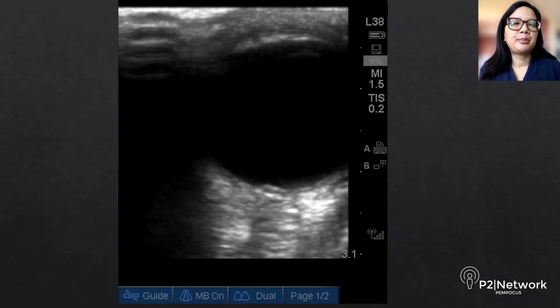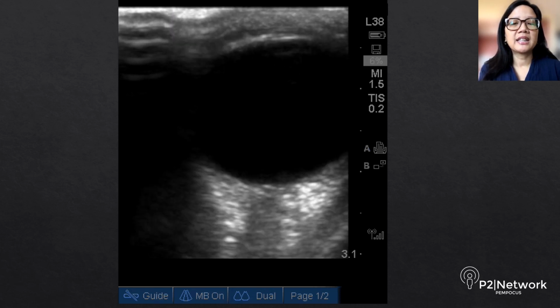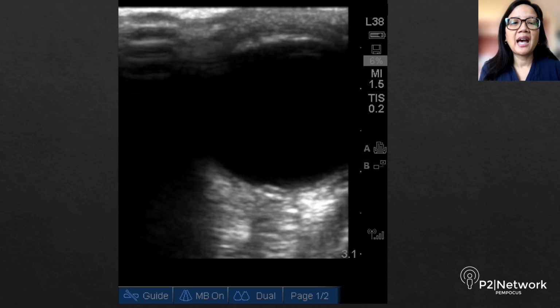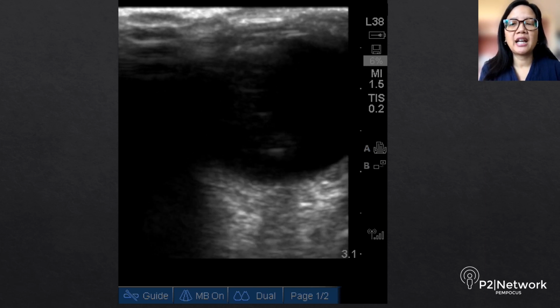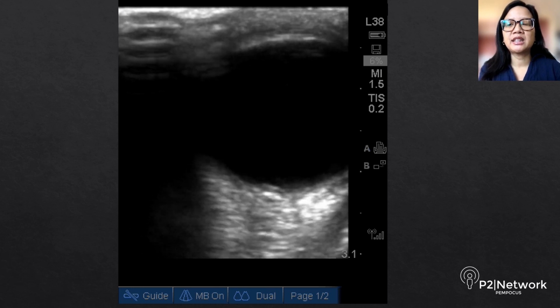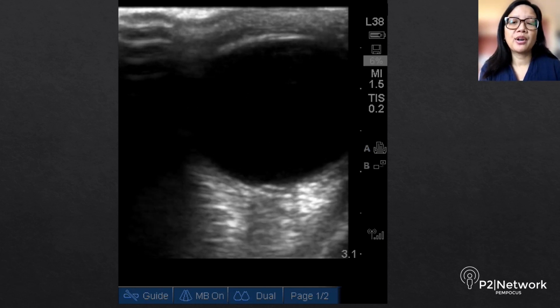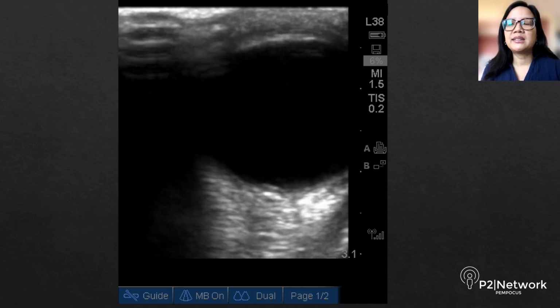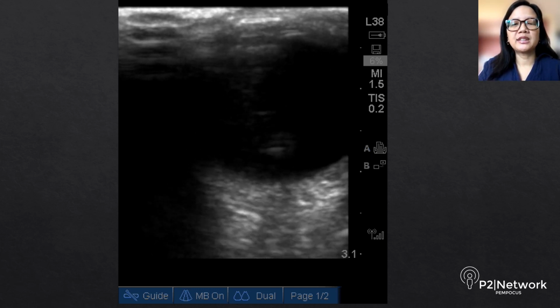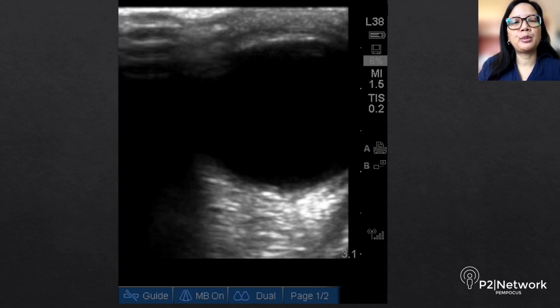Let's look at this clip from a 13-month-old girl, ex-preemie, who had IVH and had a VP shunt, who presented to the ED with vomiting and decreased activity for the day. This patient was an infant, so it was hard to get her to cooperate. But you can see here, her optic nerve is entering the retina at a bit of an oblique angle.